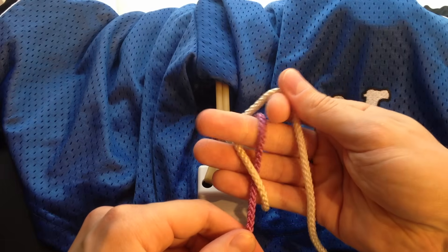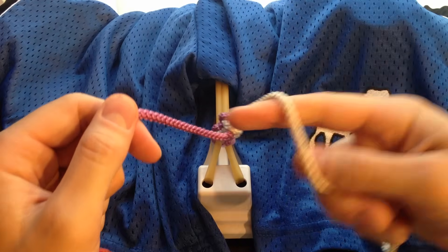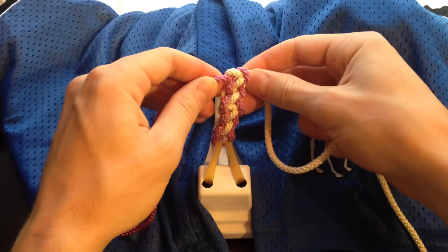Karate chop. Over, under. Pull it away from you. The claw. Over, under. Pull it towards you.